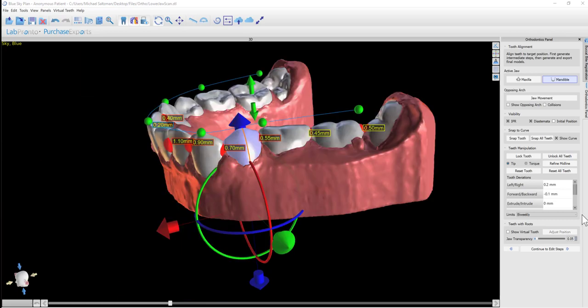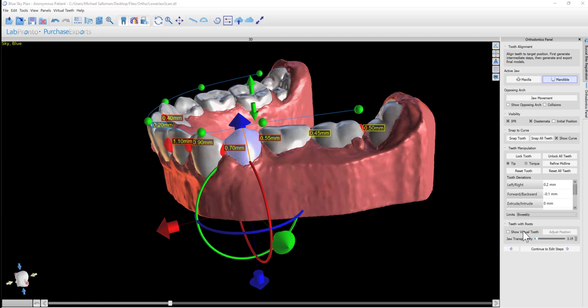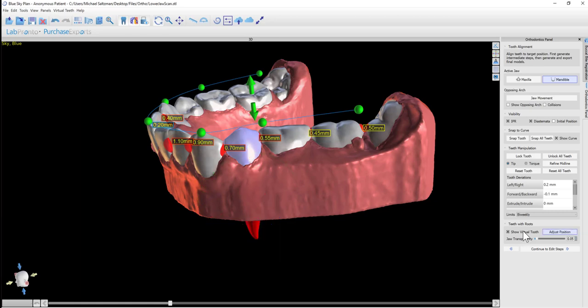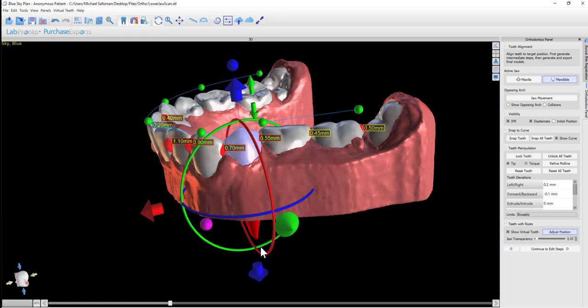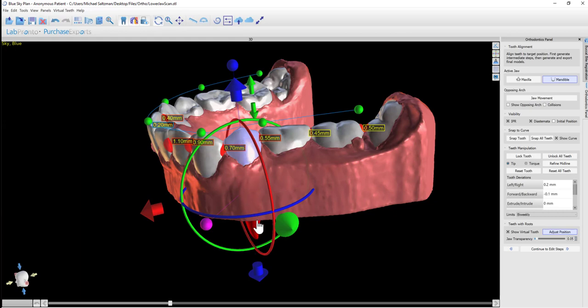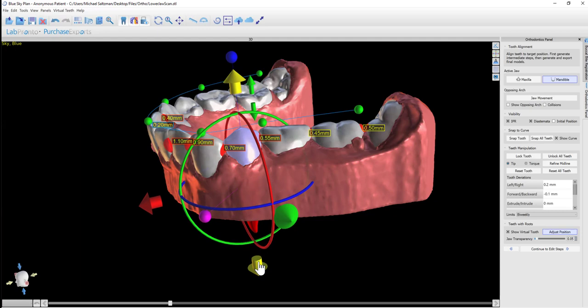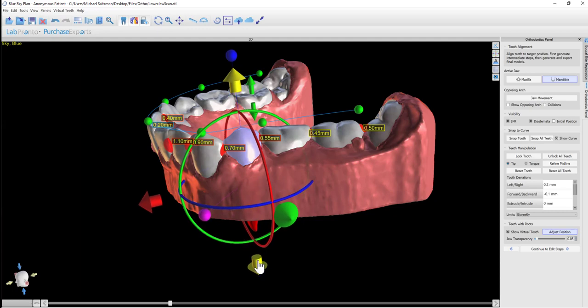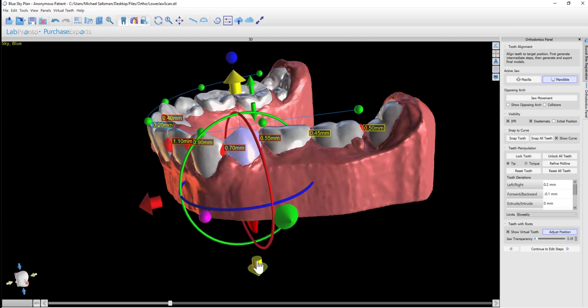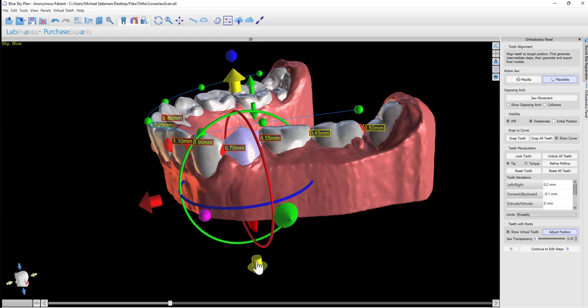The last functionality I wanted to point out on this panel is the Show Virtual Tooth checkbox. You can activate a particular tooth in the model and click Show Virtual Tooth. This will place a virtual tooth with roots to align to the actual tooth. We can fine-tune the positioning of the virtual tooth by using the widget and see how that adjusts. Once we have the virtual tooth positioned, we'll unclick Adjust Position.